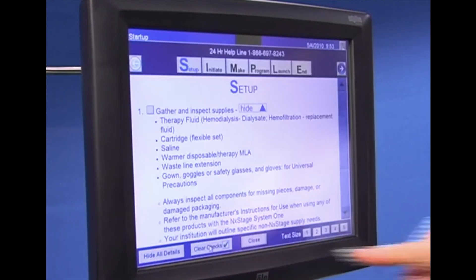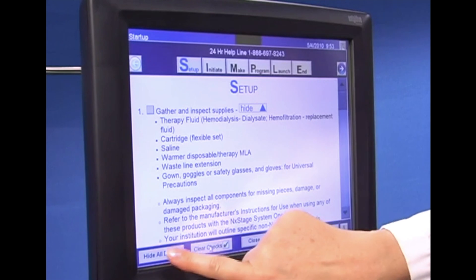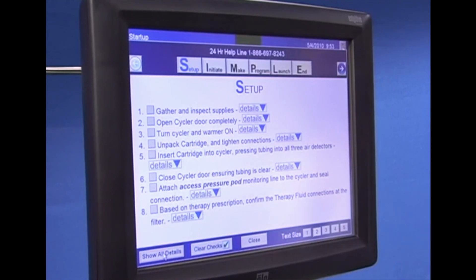Click on the simple button located on the bottom of the therapy summary screen and follow the instructions. Click on details for more information.